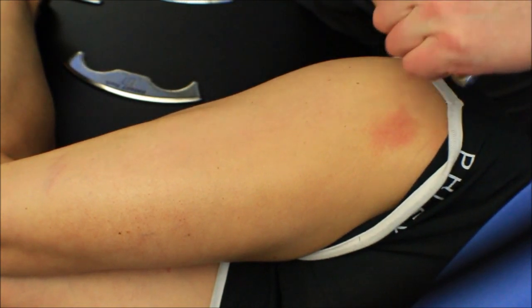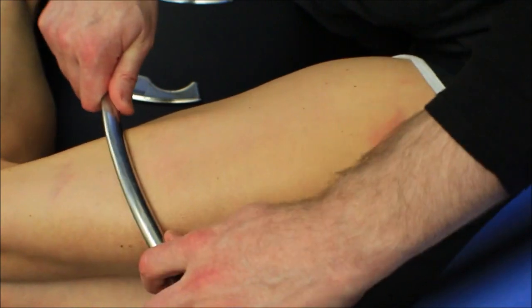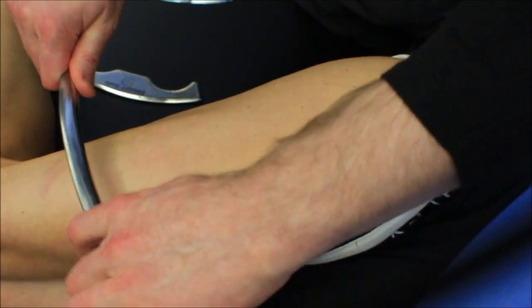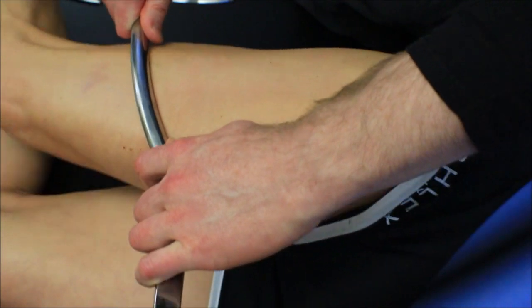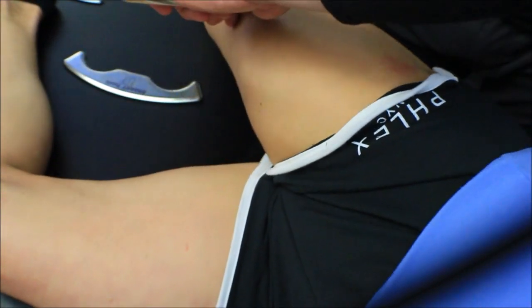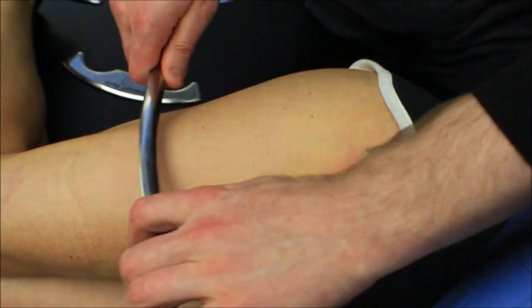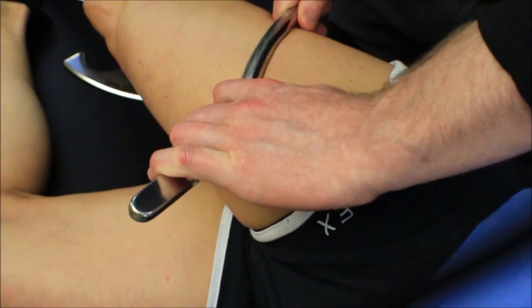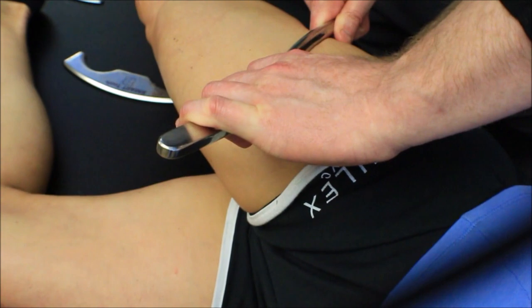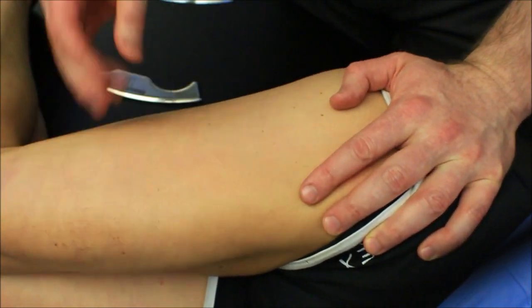Last we could do some pin and stretch to add some functional mobility. We're just going to grab some tissue — you'll feel that once you get the tools in your hand. Just do the same thing, maybe a little less steep on the angle, pull in, drag some tissue up, and then have your client extend their leg. Go into hip extension and then let it fall off the table. Hook up some tissue, extend, and then a little bit of adduction by falling off the table. I'd stick with just three to maybe five strokes in each dysfunctional area for those pin and stretch techniques, because they are very aggressive.